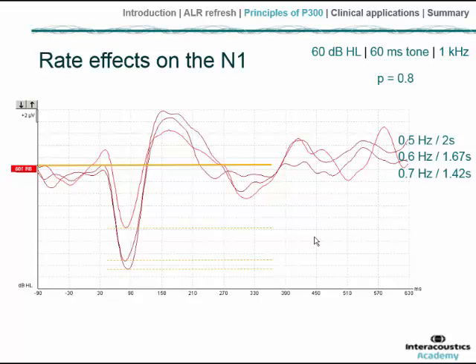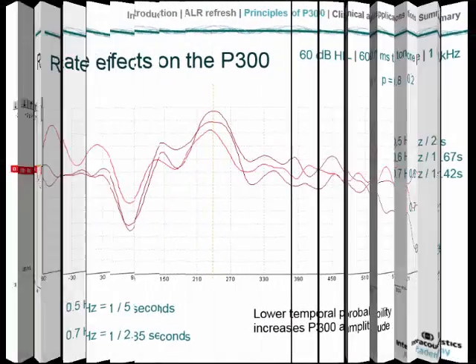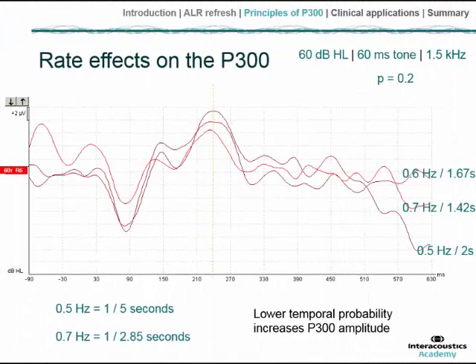Moving the discussion back to the P300 for a moment, since those were traces from an oddball paradigm — the oddball target sound was a 1.5 kHz sound presented at a stimulus probability of 0.2. This means there will be far fewer of these target traces than the standards we were just looking at.